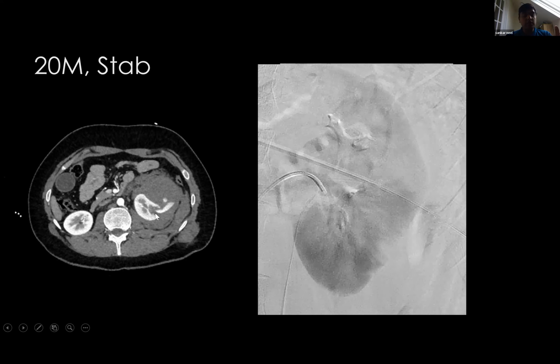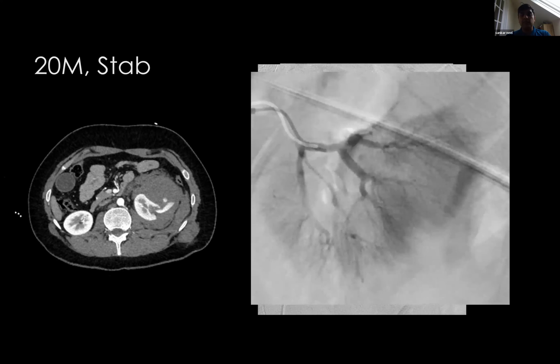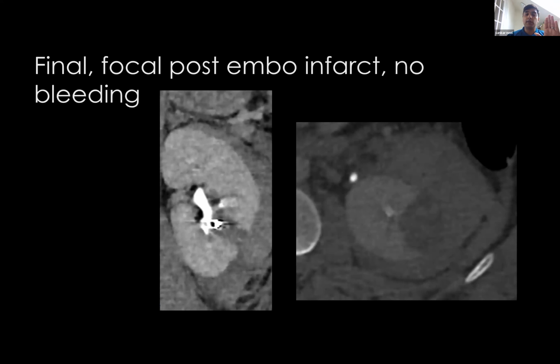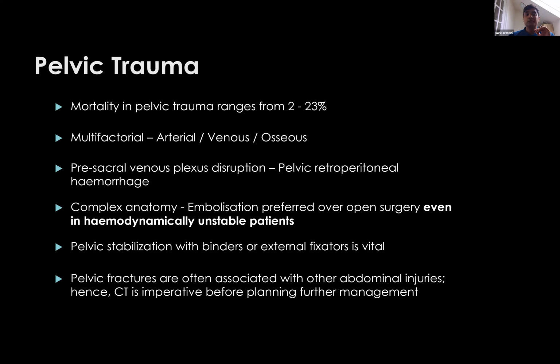And obviously, based on this CT, this patient was definitely bleeding. This is an adrenergic response in vasospasm. So we definitely need to take out the feeding branch. So we went in selectively into the space there and took out that branch distally. And this patient did really well, stopped bleeding and was hemodynamically stable. We got a CT as well to show how much of the renal parenchyma was taken out with a wedge, distal to the coil embolus.